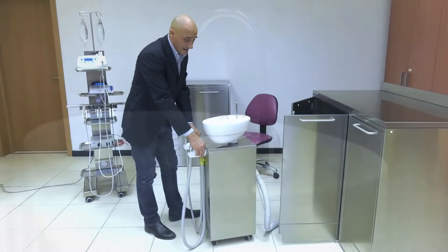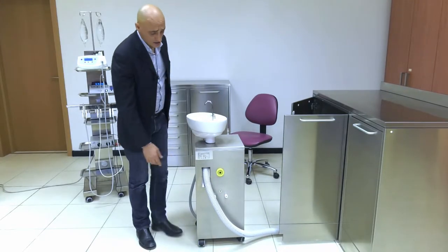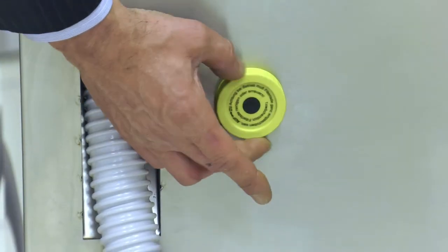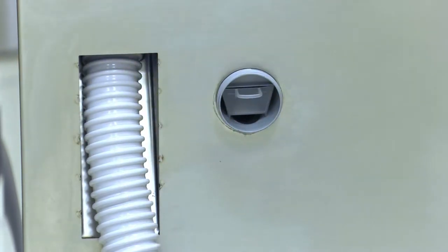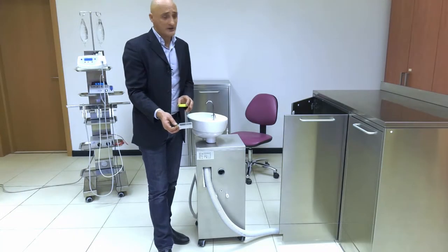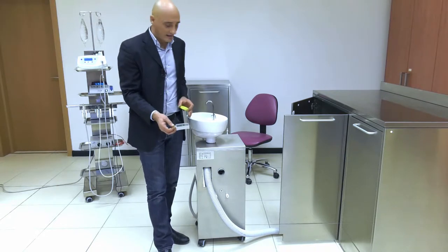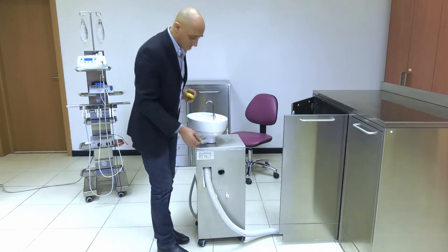By rotating the cart, you may notice another filter. This is a cuspidor waste filter. By unscrewing this filter, you can access the receptacle where all amalgam waste collects, together with all other waste produced by the procedure and transferred by the patient into the cuspidor.